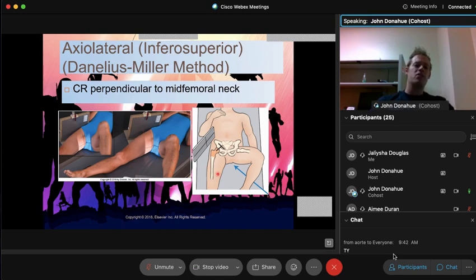So as far as the positioning, guys, we, of course, want the affected side to have a cassette right next to it, with that cassette slightly turned to match the angle of the leg. And we want that central portion of the cassette. You see where that little marker is, that little line? That needs to line up with your femoral neck. Now, I suggest that you put your film by the leg first. Don't put your tube here first, because that's going to confuse you. Put your film in the right location first, then move your tube into position, 40-inch SID, put your crosshair right on the mid-femoral neck. By the way, look for the crease of the leg, just like you did for that frog lateral. Look for leg creases. That's the femoral neck. Put your crosshair right there.